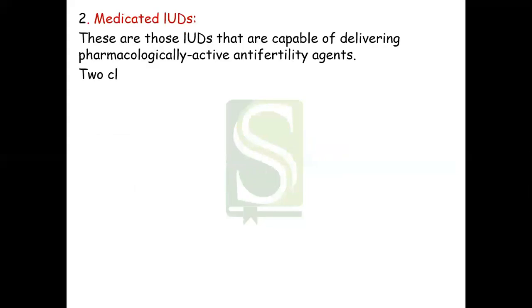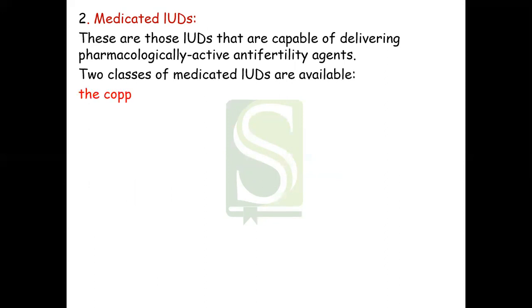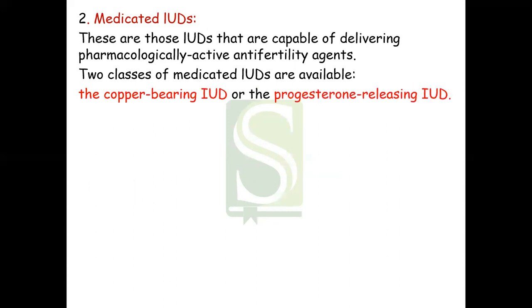The medicated IUDs are capable of delivering a pharmacologically active anti-fertility agent. Two classes of medicated IUDs are available: the copper-bearing IUD and the progesterone releasing IUD.